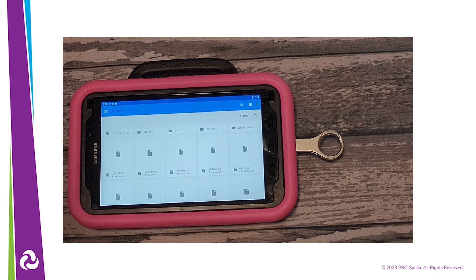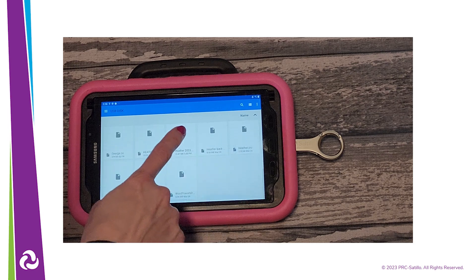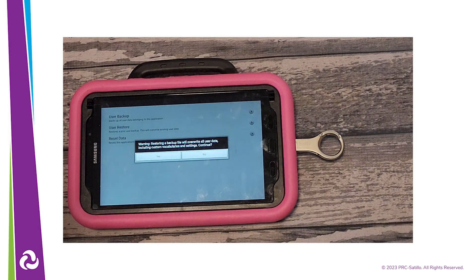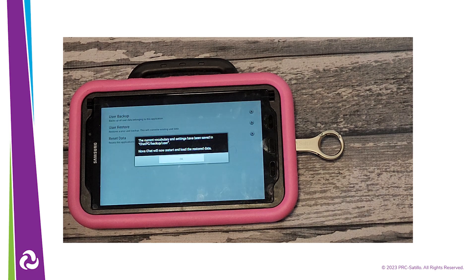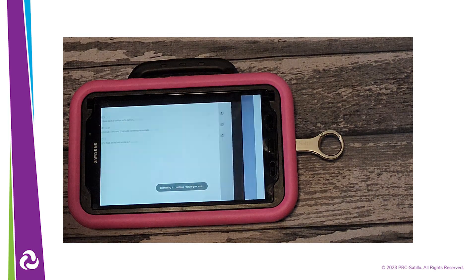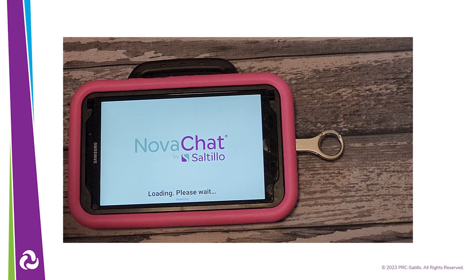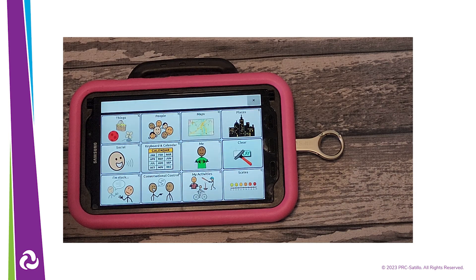Find the user saved on the USB and tap on it. You will get a warning that the restore will overwrite all user data on this device — select Yes. The restore process may take a minute to complete. Once the restore is finished, you will see a pop-up and you will need to restart the NovoChat by tapping on OK. Allow the NovoChat to restart and the chat software to load, then tap on OK when the restore is complete.